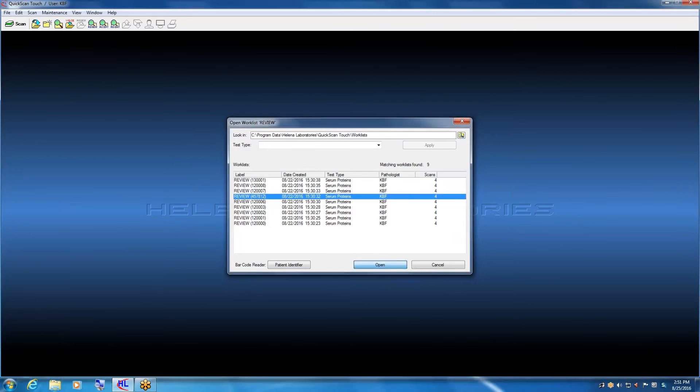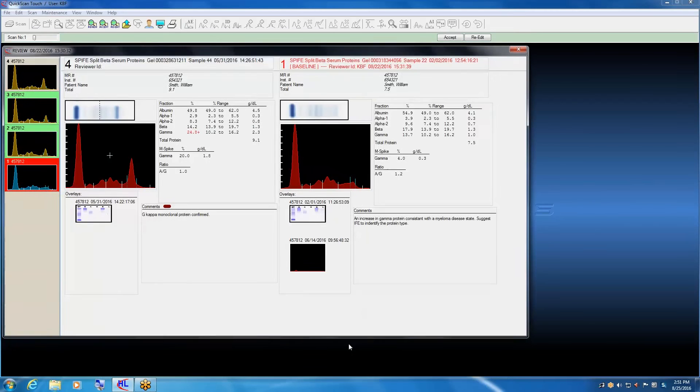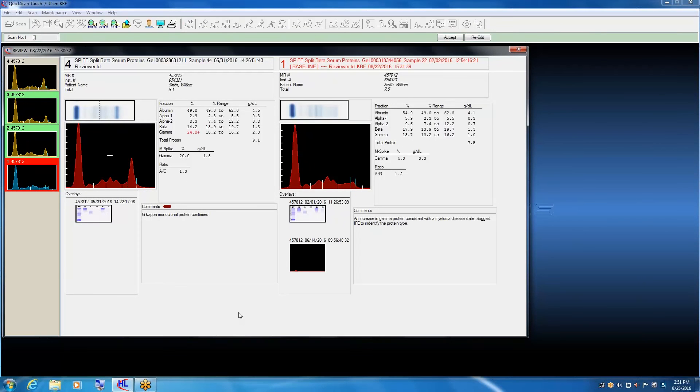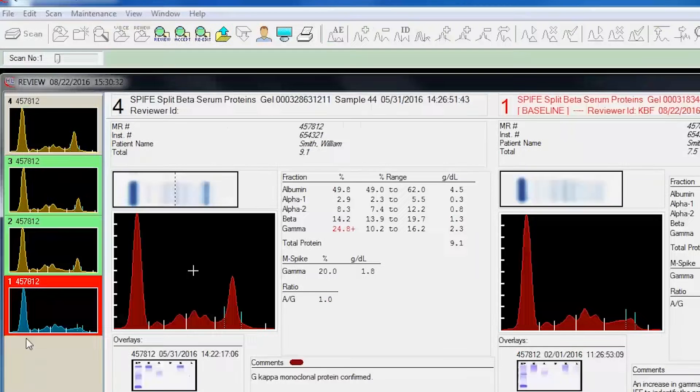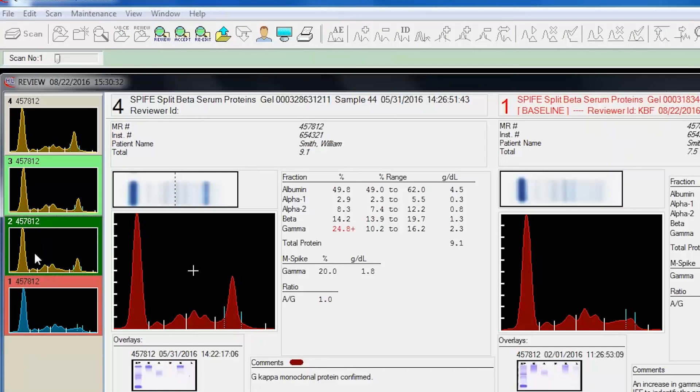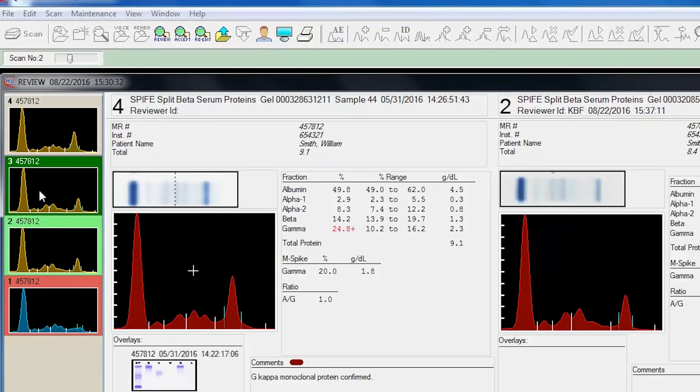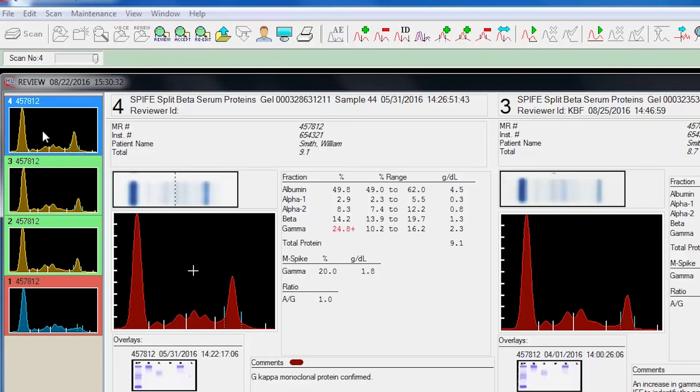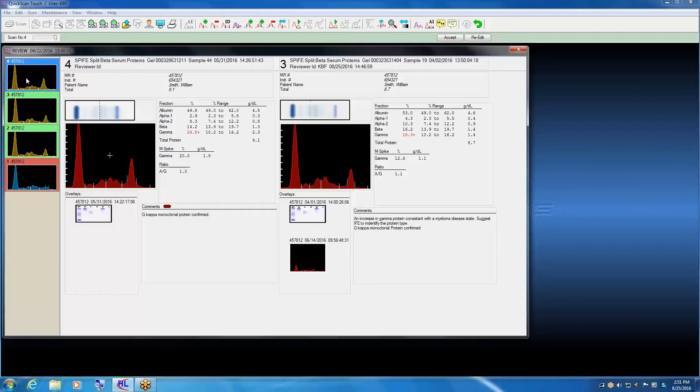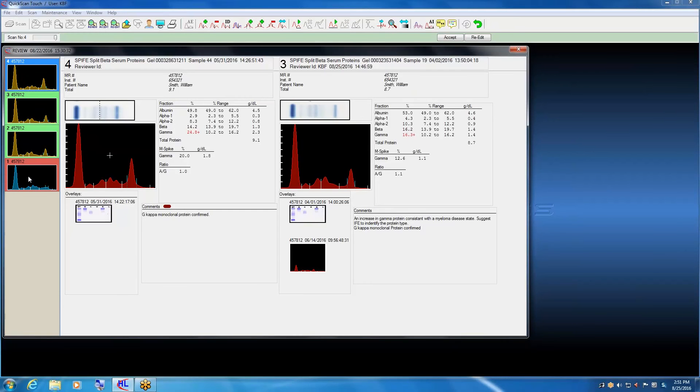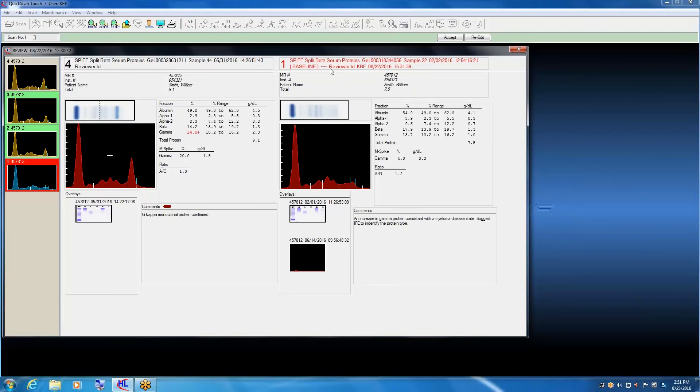Immediately, you see that there are a number of patterns on the screen. In the left-hand column, we have thumbnails which represent all of the historic samples, all the historic protein samples that have been done on this patient. And the one in blue is the current sample. The one in red, the oldest.